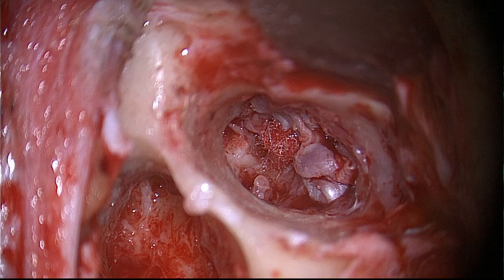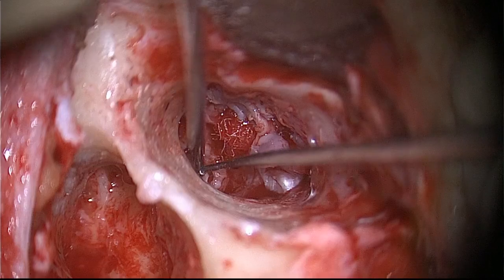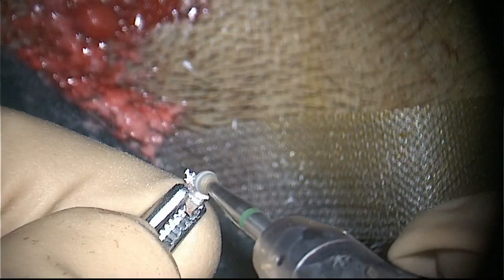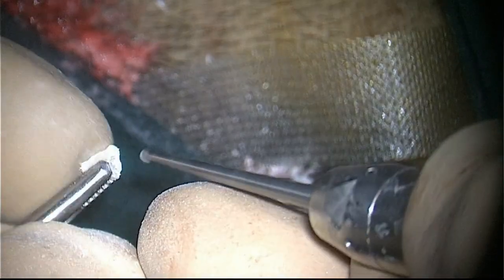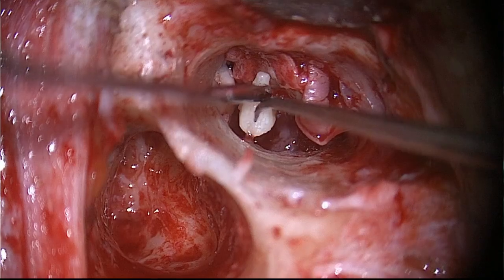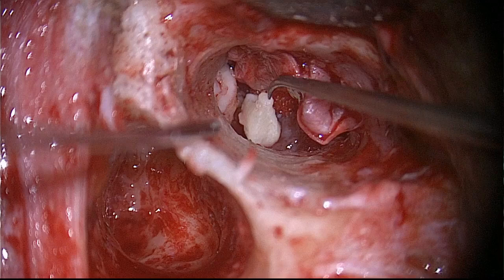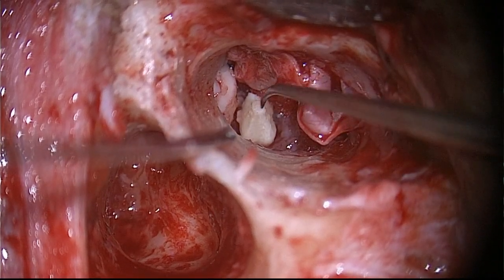In this presentation you can see the incus is removed and the same incus is being used, sculptured. You can see the incus being sculptured and a facet is made in it by taking a 0.6 burr, and this incus is going to be made to sit on the mobile stapes. You can see it's a tight and good assembly. The prosthesis is unlikely to fall.